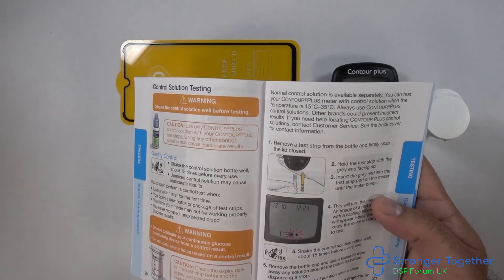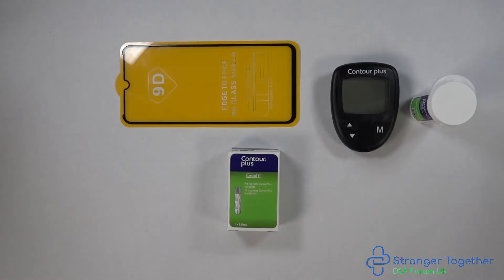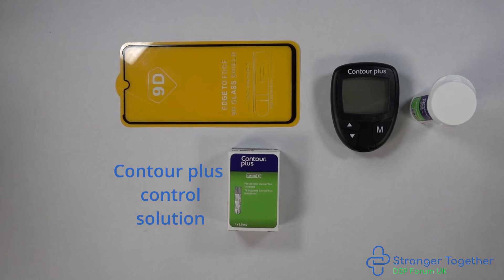Now let's show you how to perform a control test. You need a clean hard dry surface — here I'm using a mobile phone glass screen protector, but you can use any clean dry hard surface. You'll also need your Contour Plus meter, your test strips, and the control solution. Ours here is marked with the letter N.